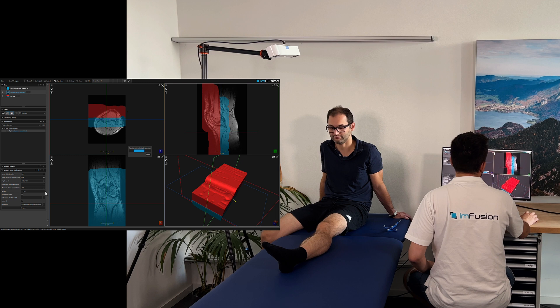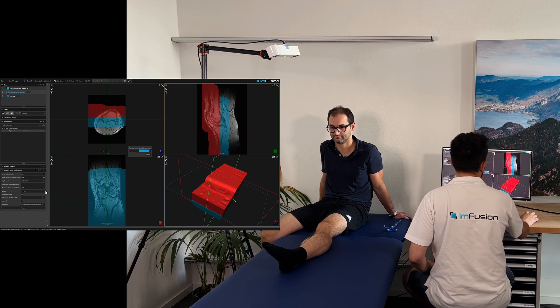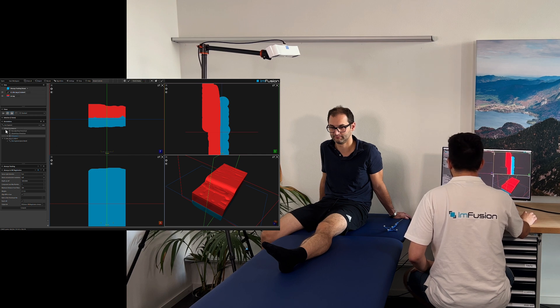We will now acquire the 3D scan and run the registration. As you can see, within a few seconds the registration process has been completed.